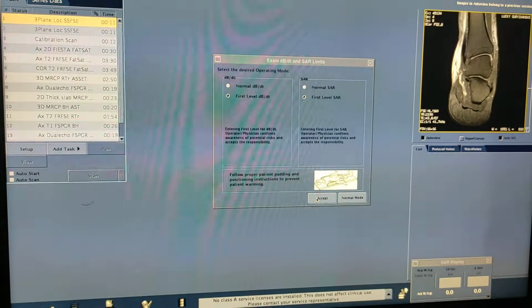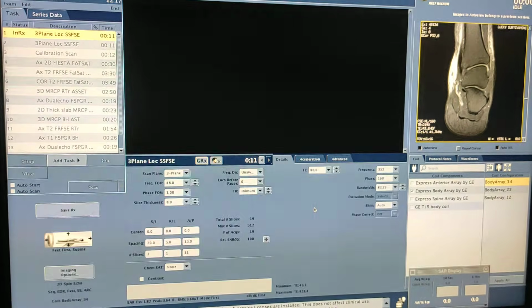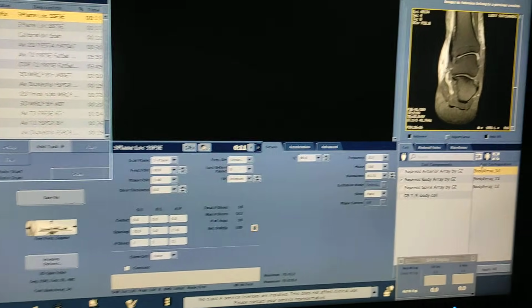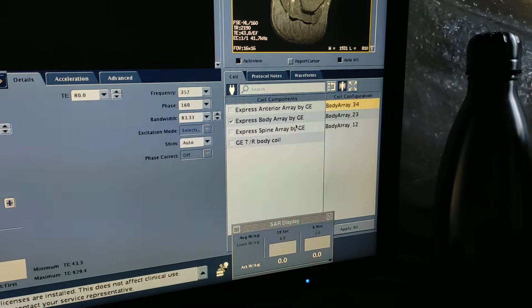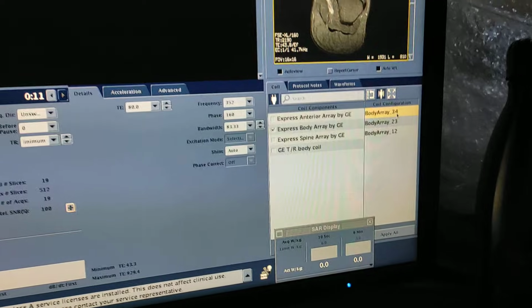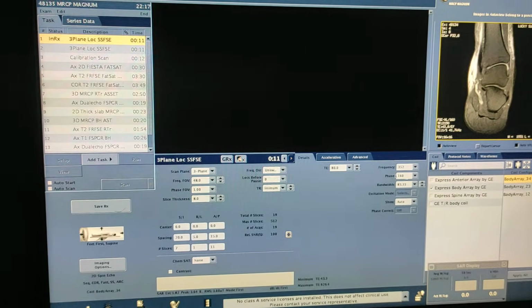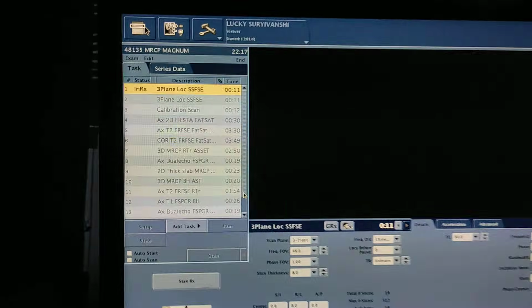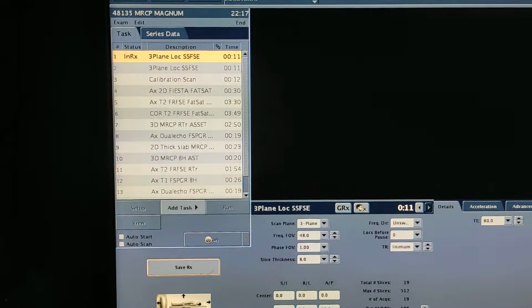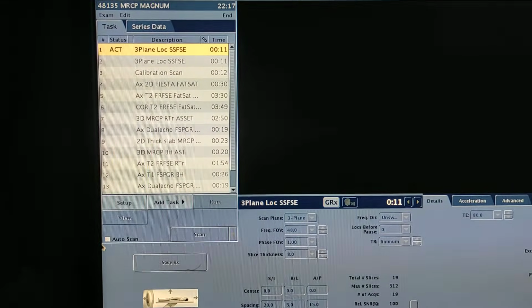Before scanning, always take a history of the patient, and you should know the anatomy of MRCP. Here you can check, the express body array coil has been connected. Body array 3-4. I have shown the positioning. So first of all, we will take the tri-plane localizer. Save. Scan.